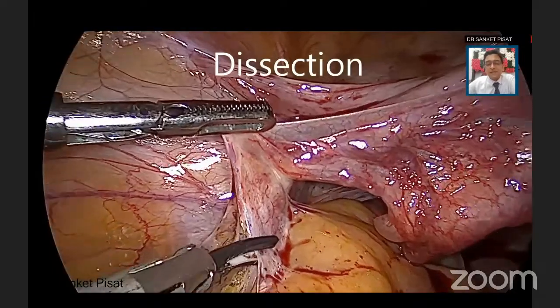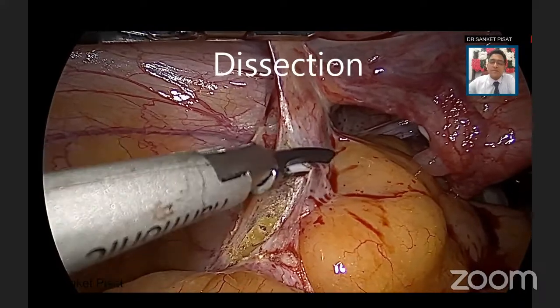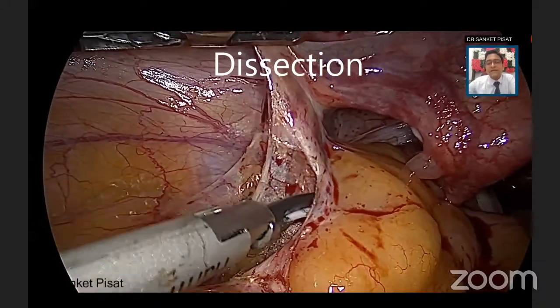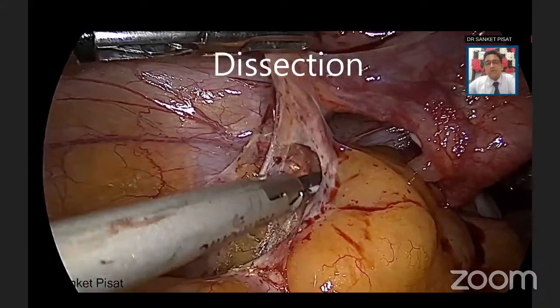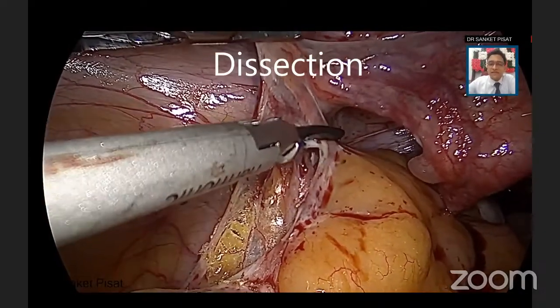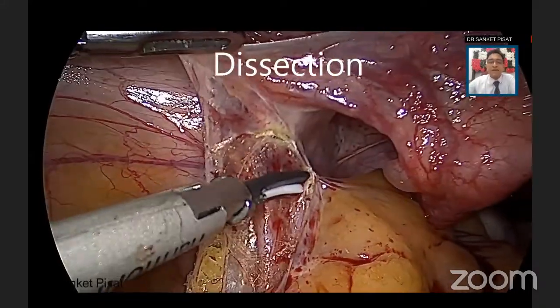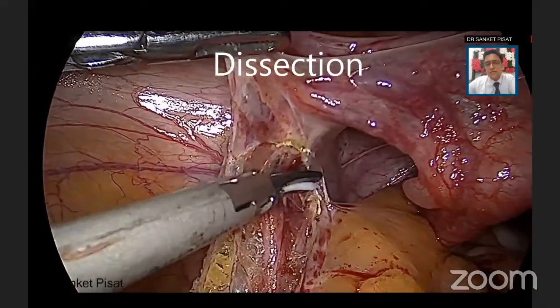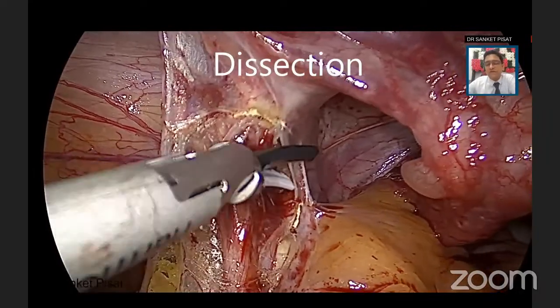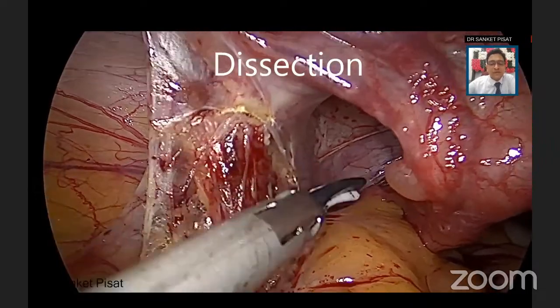So what are the other applications? One of the applications is dissection. You can simply use it as a dissector, like a cold instrument, where you use it without energy to simply dissect the planes of the tissue away from each other, and then you can combine it with the cutting function, much the same way as you would have probably used a blunt grasper or a Maryland in order to do the surgery. So it can be used very well for dissection because one of the jaws moves and it opens out very widely. This is very good for us for doing dissection and pushing the tissue planes away.